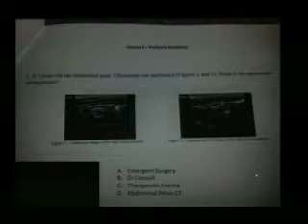On the transverse and longitudinal views of the right lower quadrant, there is a structure that's hyperechoic with central hypoechogenicity. I'd suspect, with the history and the images, that maybe that's an inflamed appendix. Okay, what if I told you there's this echogenic on the outside and hypoechoic, and echogenic and hypoechoic? Maybe intussusception. Correct. This is the pseudo-kidney sign and this is the target sign.